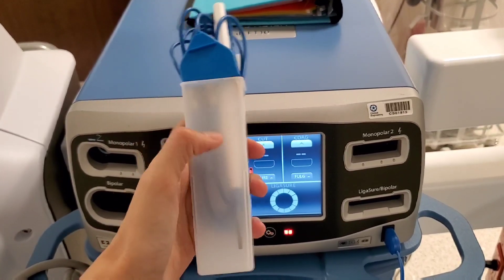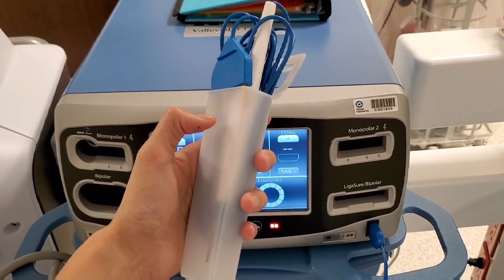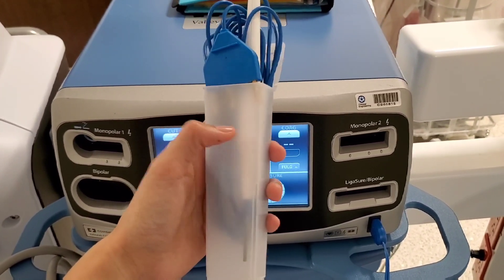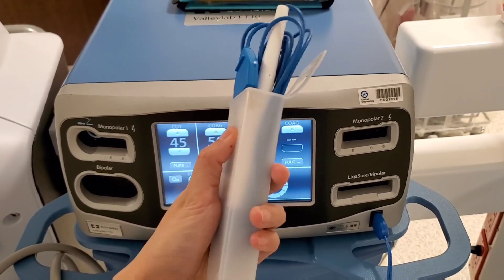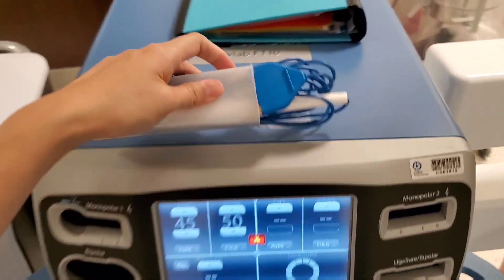So when you open it, it looks like this. It has this little plastic thing where you can put your bovie so it doesn't accidentally burn the patient. A surgeon actually wants this all the time in the field. I'll show you guys how to hook it up on your mayo stand one of these days when I get another case. But today I'm going to show you how it looks.